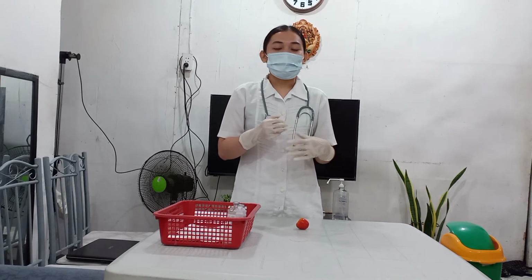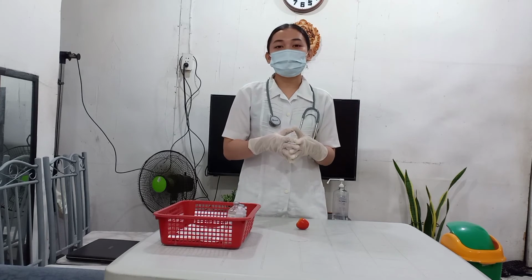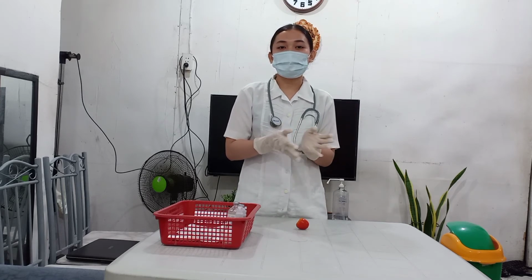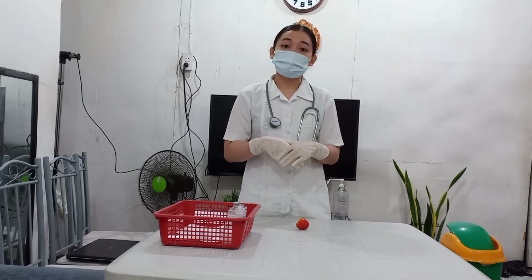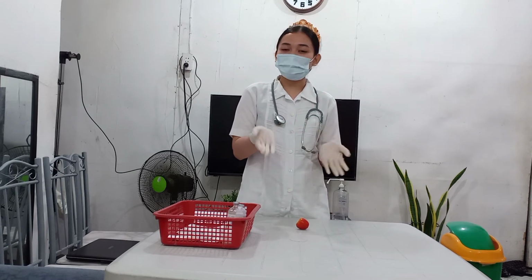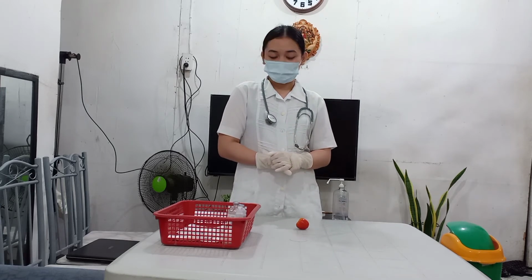So, since I still cannot administer a subcutaneous injection or any parenteral medication during this return demonstration without the supervision of a licensed nurse. I have here a tomato, assuming that this is my patient.